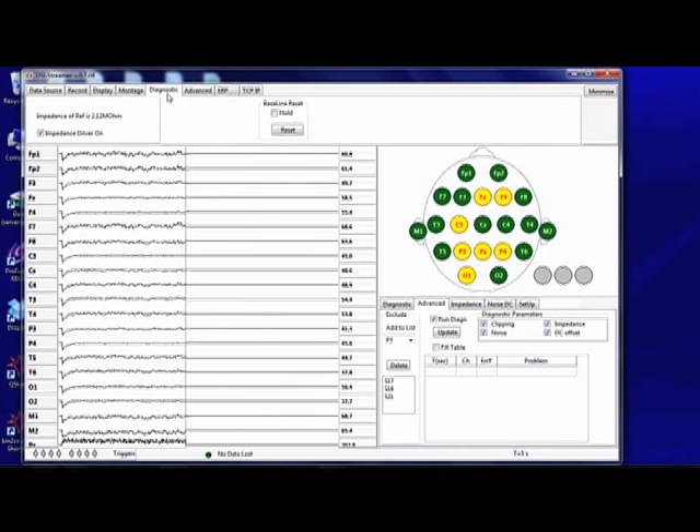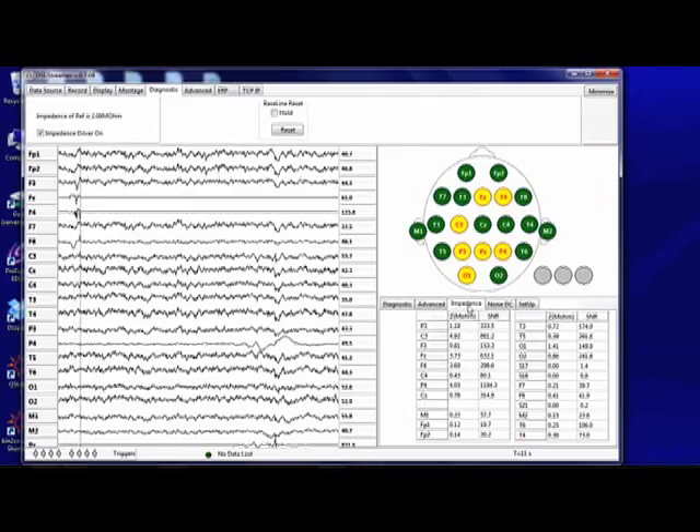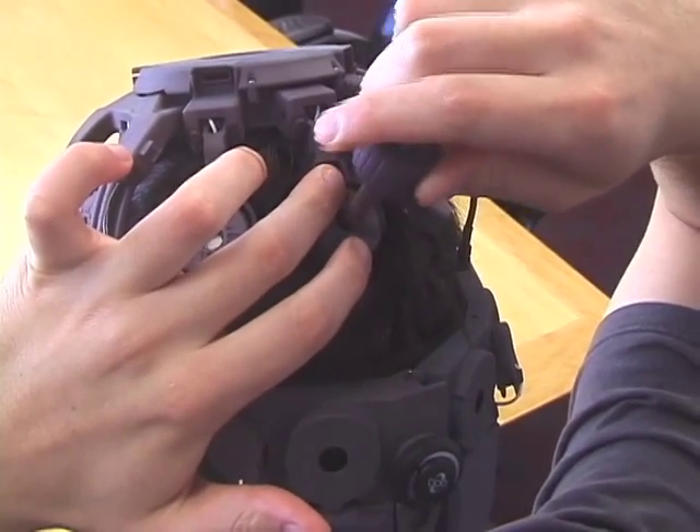Next, go to the Diagnostic tab to inspect electrode impedances. You will need to manipulate any sensors that are in yellow or red. A graphical representation of the electrodes is color coded to show contact quality.